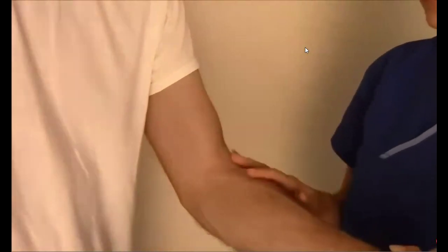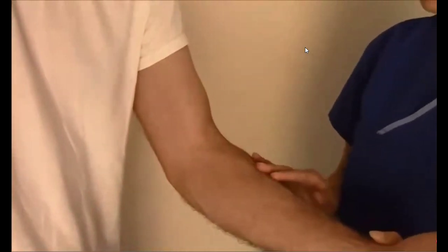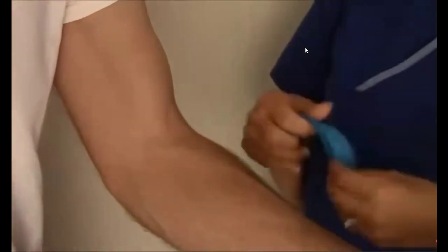Okay, first you'll want to tell the patient what you're doing, that you're going to be looking for a vein. You probably want to spend a minute or two trying to find a vein. And if you notice his veins, you can see them already without a tourniquet. Most people, you have to put the tourniquet on to get these veins to pop out. So here in a second, I'll put the tourniquet on. But notice you can already see his veins.